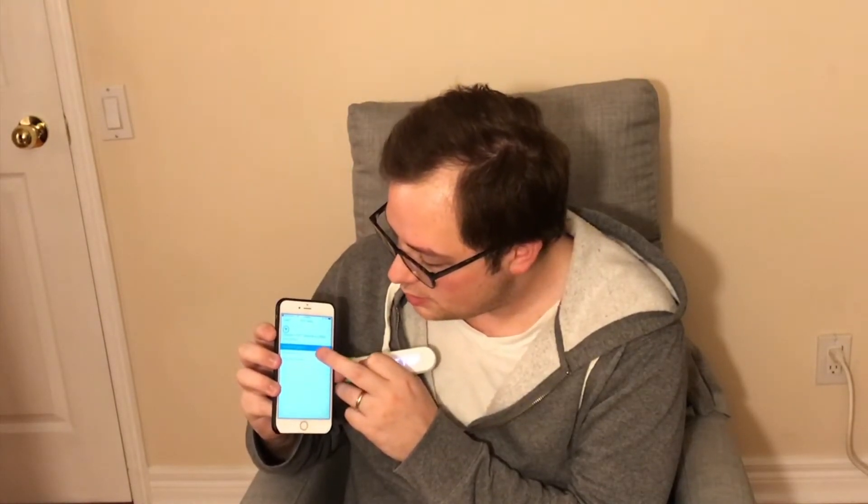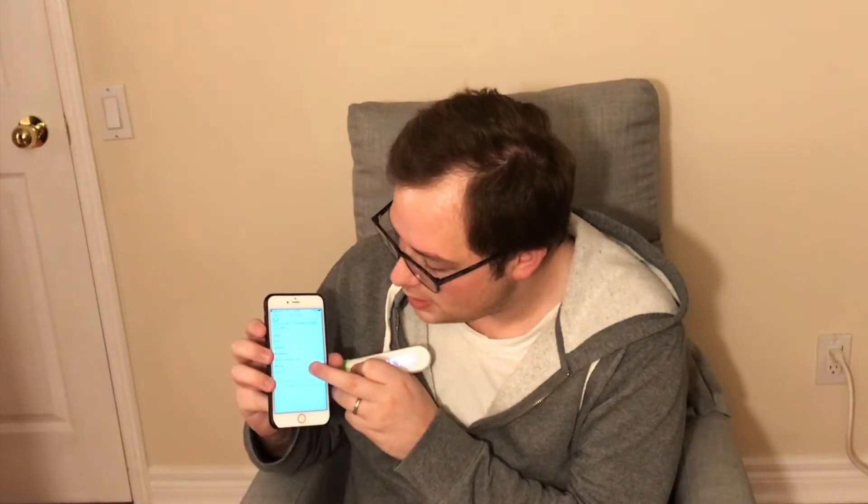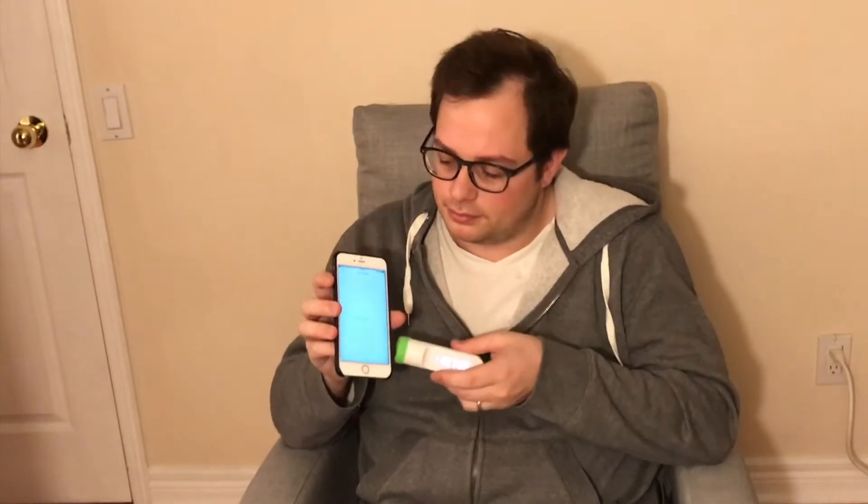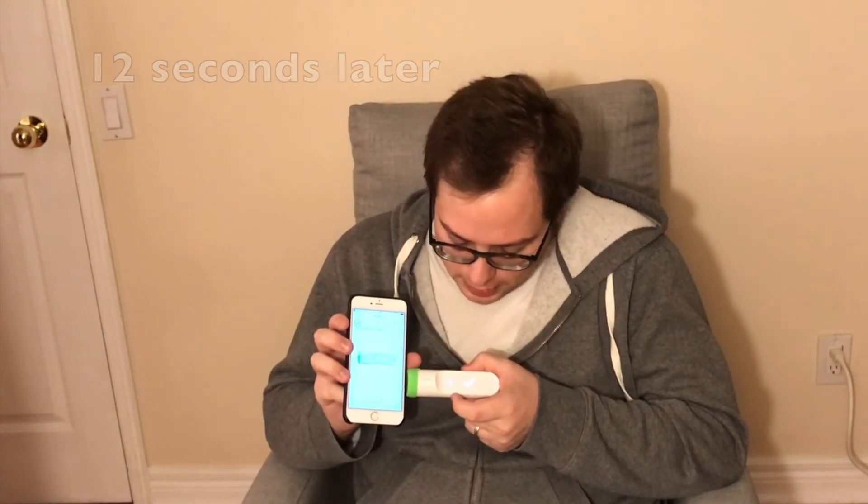It's configuring the device now. My phone is talking to the Thermo through Bluetooth, helping it set up to the home Wi-Fi so it can connect through the internet to my Withings account. Activating your thermometer... there's a check mark on the LED — that's a good sign. Thermometer activated!